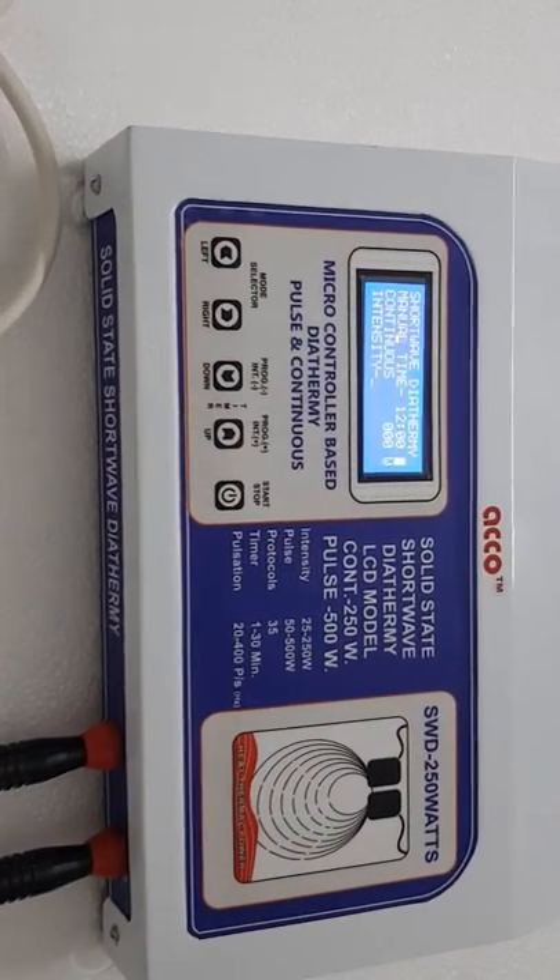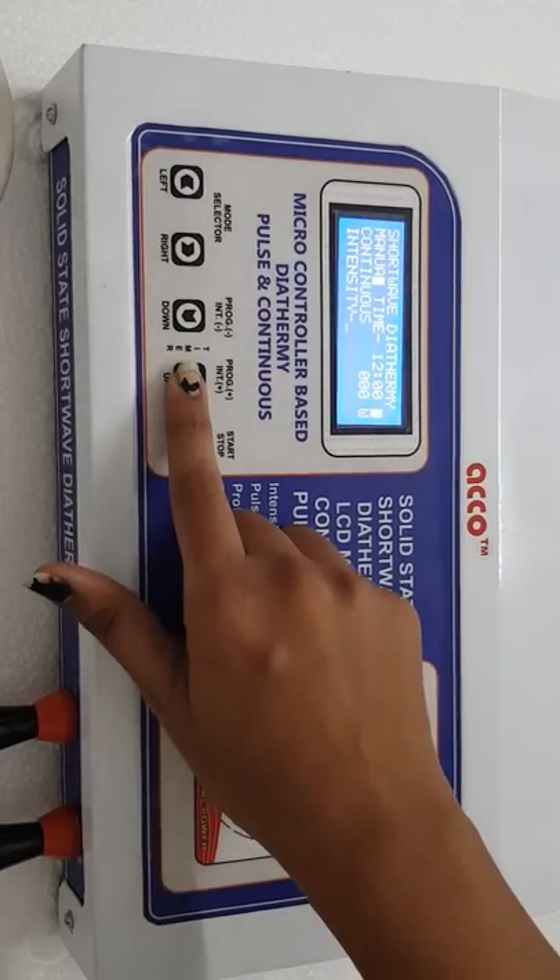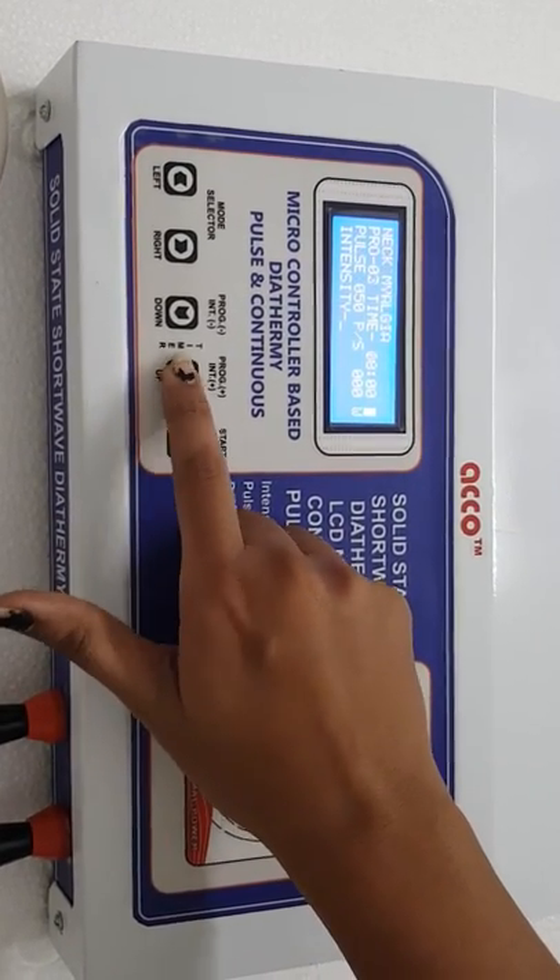The machine has 35 manual programs — Program 1, 2, 3, 4, and so on.